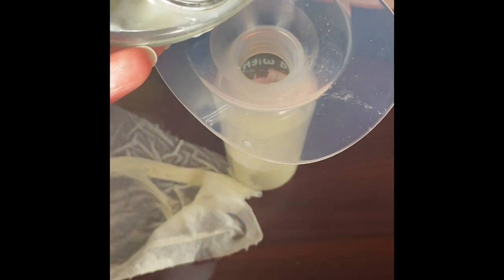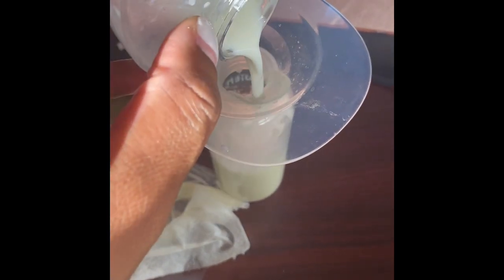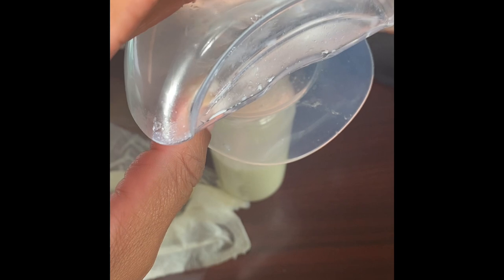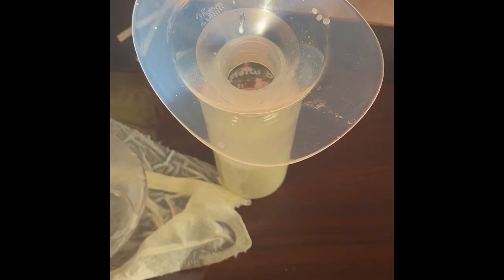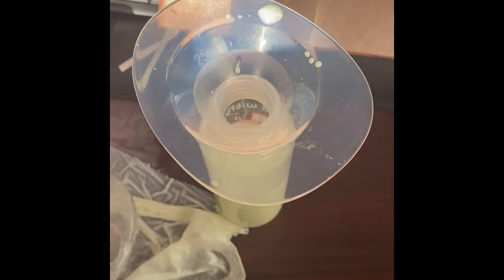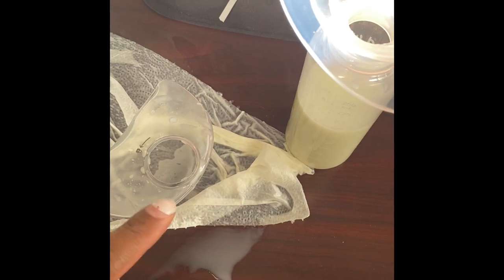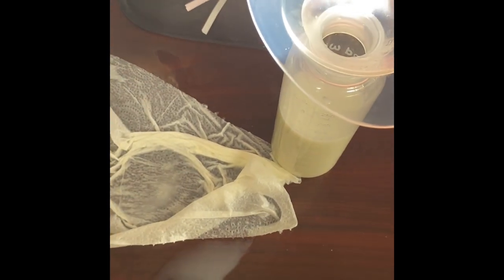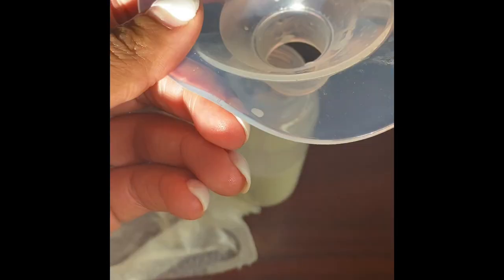As you can see, when I would pour it in there, it would tend to kind of go down the back of the container. But what I do is take this shield — which would look like this on the breast pump — I take that off, place it on the bottle, and I pour in there so it can catch all the milk. Not this milk that I'm going to cry about later, but it will catch the milk and prevent it from wasting onto the table.